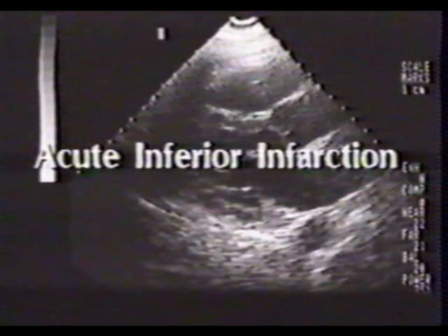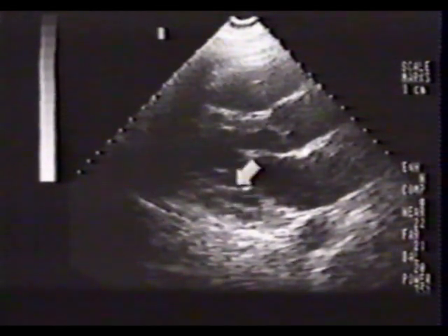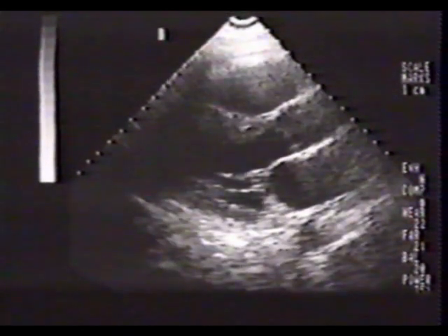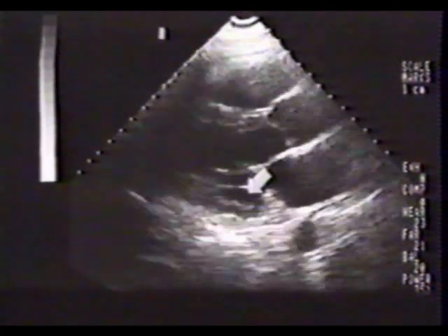This patient has an acute inferior infarct. In this diastolic frame, note that the inferior wall still appears normal in thickness compared to the septum. Now, in systole, it is obvious that the septum has thickened normally, while the inferior wall has not changed in thickness. In real time, the lack of systolic thickening is obvious.